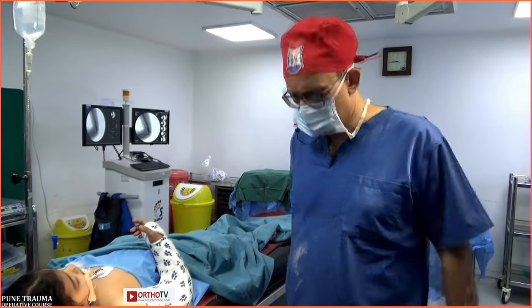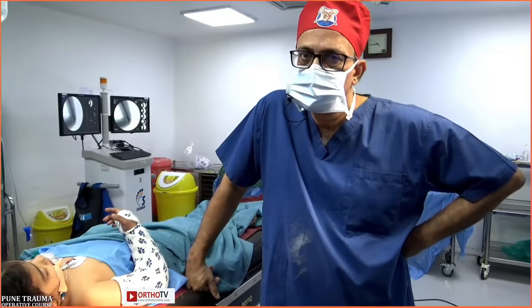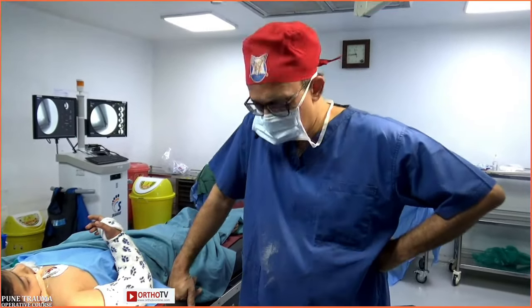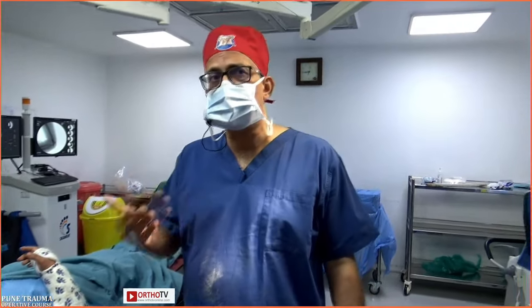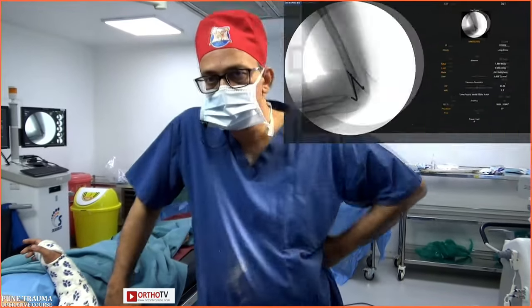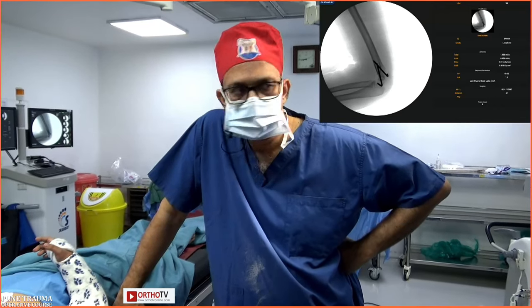Dr. Agashe. Sir, excuse me, sir. One question. Sir, if the reduction is unstable, how can you hold the reduction before putting the K-wires? Sandeep, if the reduction is unstable, what would you do? If it is unstable only on rotations, I will add a medial pin. No, how can you hold the reduction before putting the K-wires, sir? Will only simple flexion hold the reduction, or are any maneuvers needed?